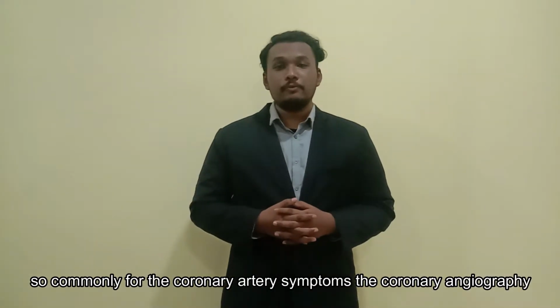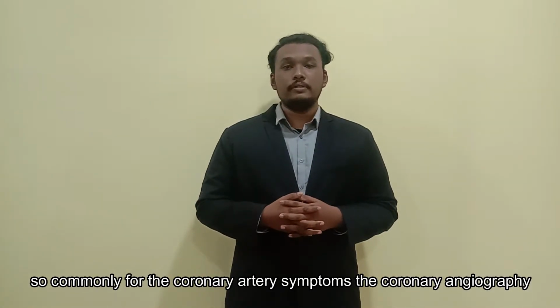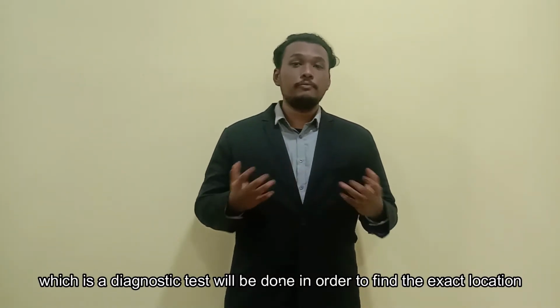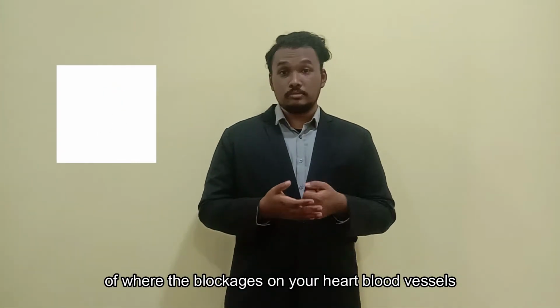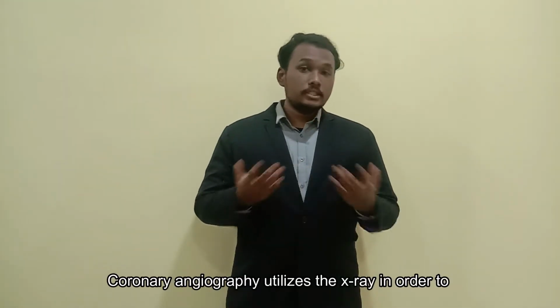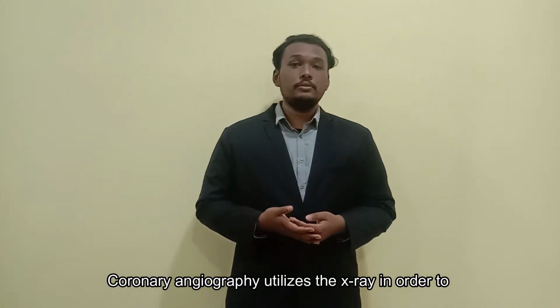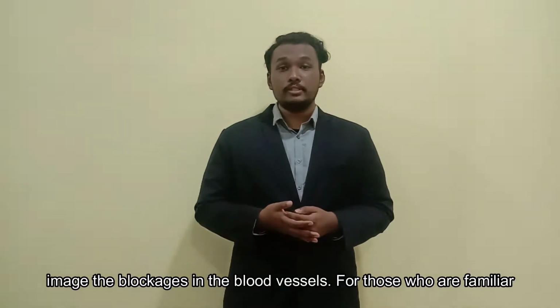So commonly, for coronary artery disease symptoms, coronary angiography, which is a diagnostic test, will be done in order to find the exact location of the blockages in your heart's blood vessels. This coronary angiography utilizes X-ray in order to image the blockages in the blood vessels.